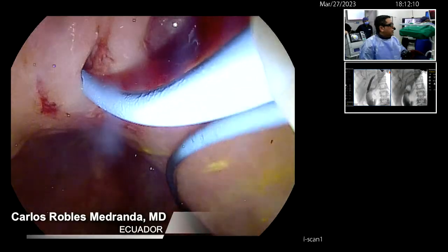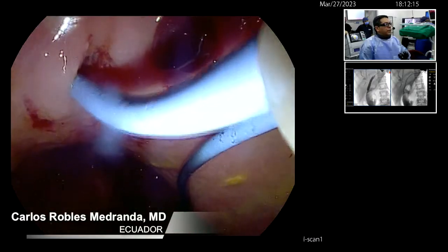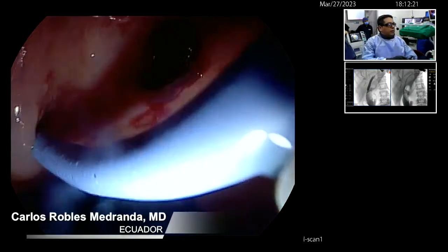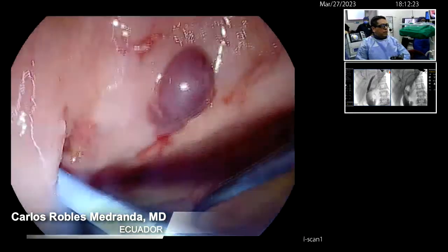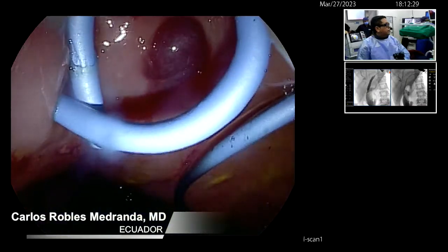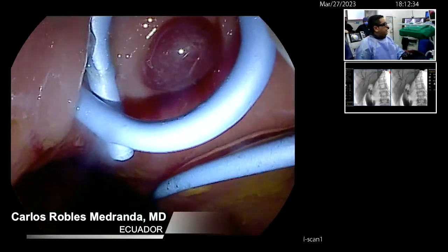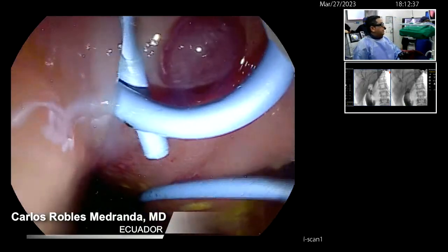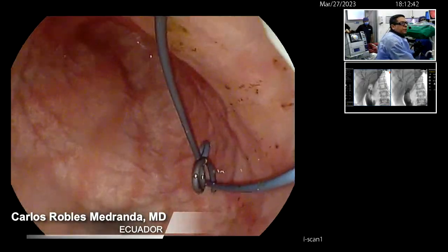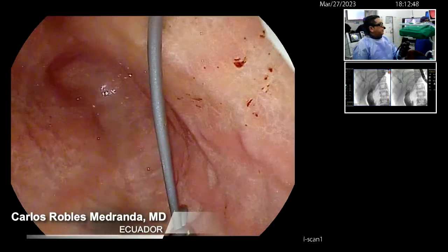Very good, my friend, very good. I'm very happy now. Okay, libera. Okay, perfecto. You see? Perfect. Huh? It's from the right to the left. So we finished now. I believe it's a very nice demonstration. We had the chance, and this patient will be solved. I will retake these stents, and we will see in 2 months how it's going. So just one stent, and it's perfect.